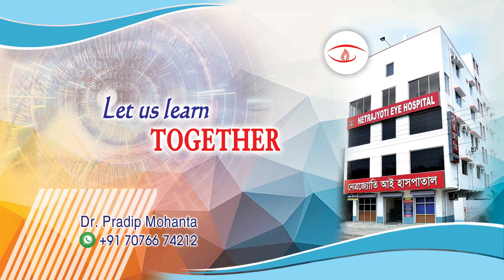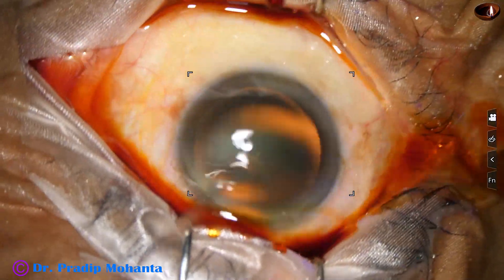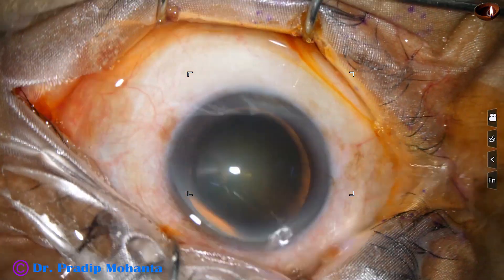Friends, welcome to my workpiece for hands-on FECO and SICS training. Let us observe this totally unaided surgery.